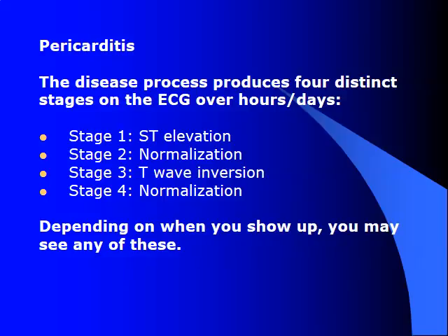Pericarditis usually evolves over days to hours. Your first stage is going to have ST elevation, and then you'll have a normalization followed by a T wave inversion and a normalization. So depending on when you get there, you may see any of these.